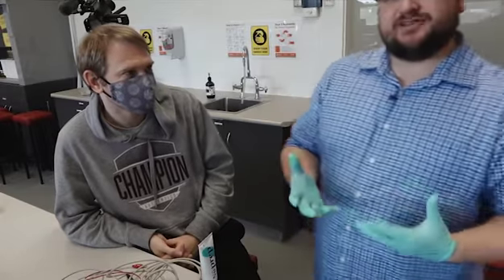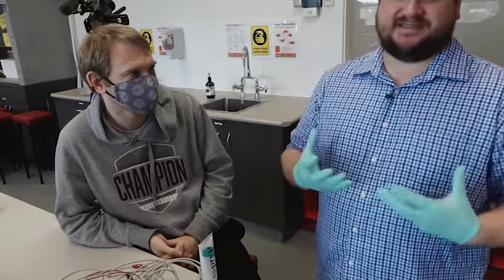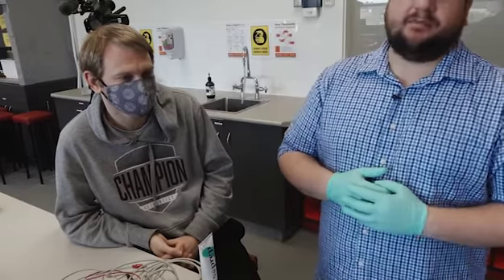Before you attach your electrodes, the first thing you need to do is clean down the electrode attachment sites. Please check out the previous video outlining how this is done correctly.